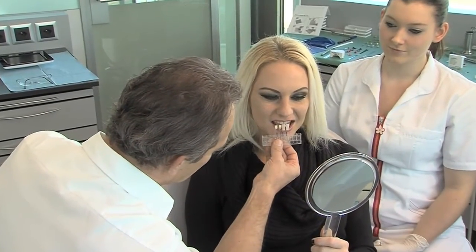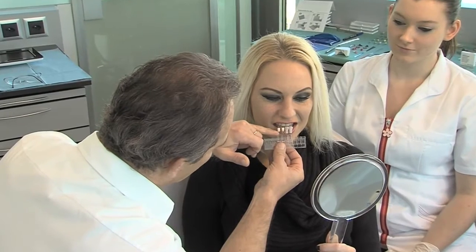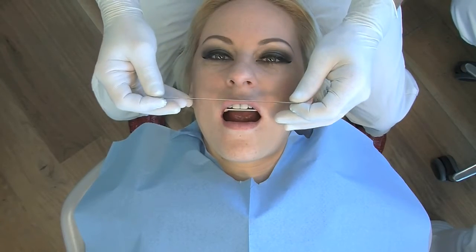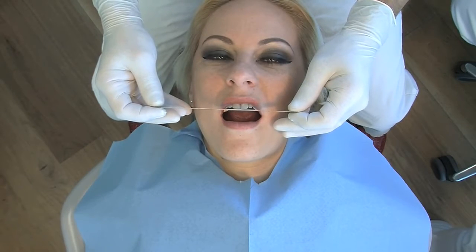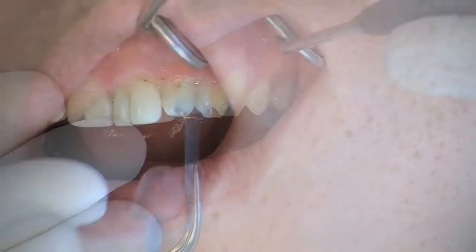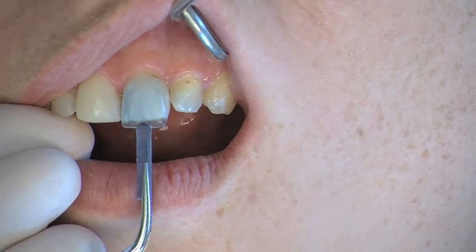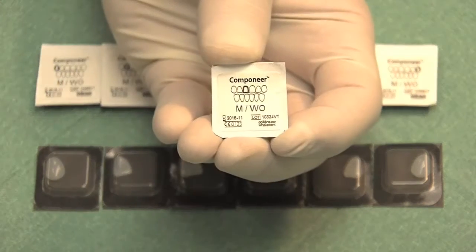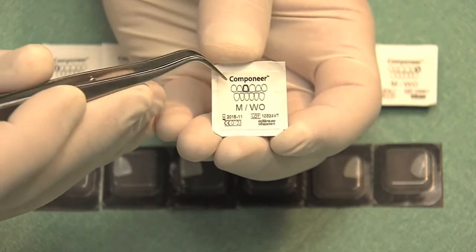Patient and dentist can jointly select the target shade using Coltene Whaledent's shade guide. The shape and size of the componeers to be placed can be determined by using the contour guide. The componeers are individually packaged, and the sheet on the reverse side serves for patient documentation.